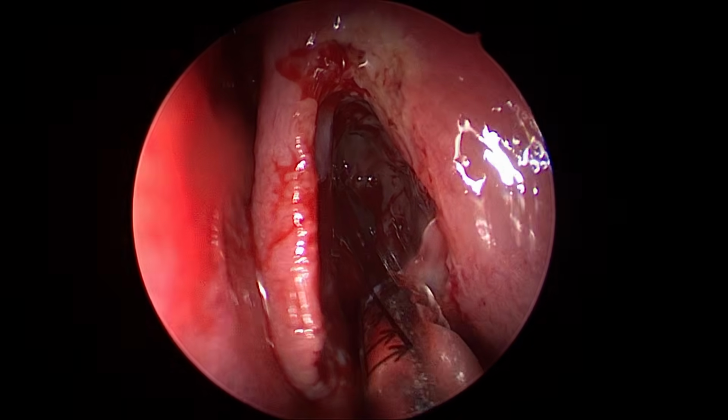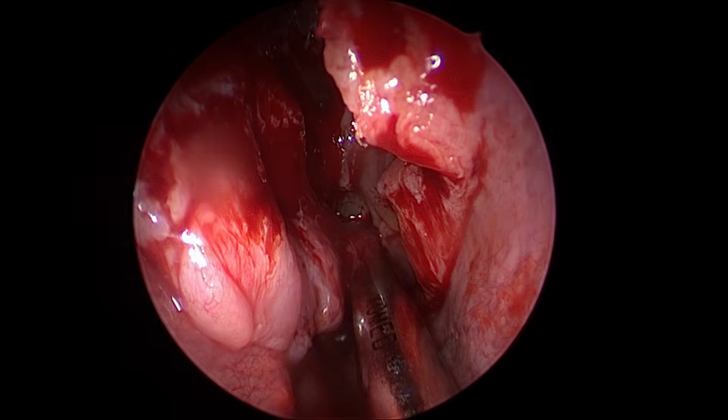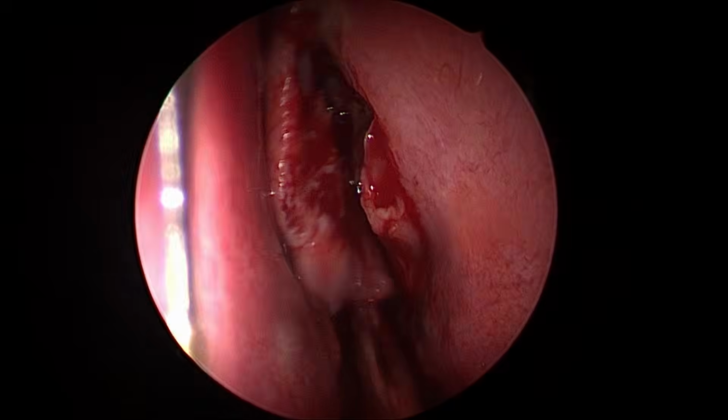Now see, this uncinate is still there. Can you see? Yes, sir. The previous surgeon has not even done an adequate uncinectomy.